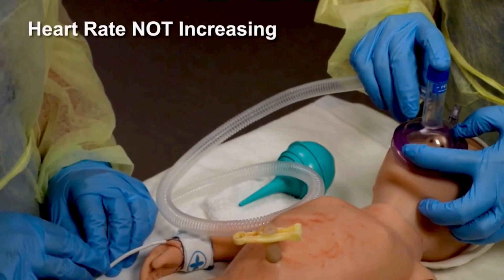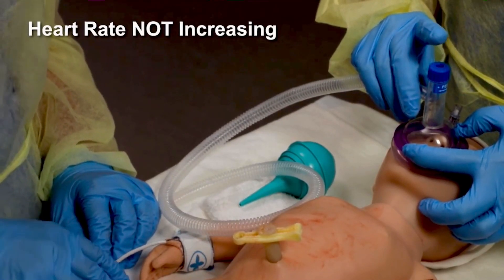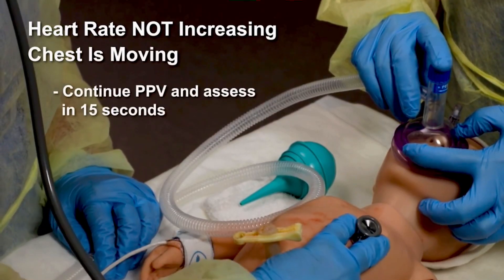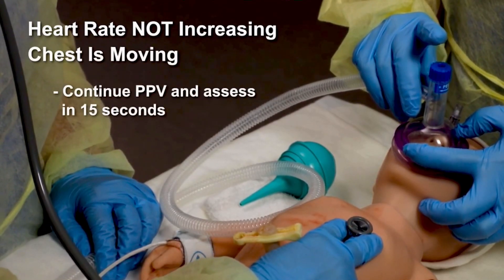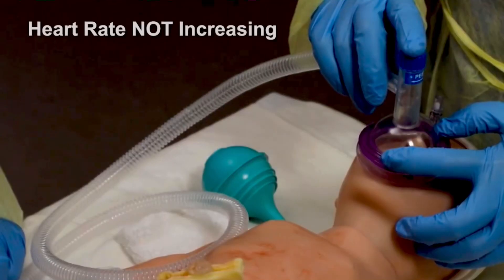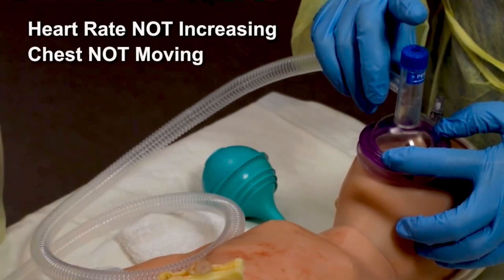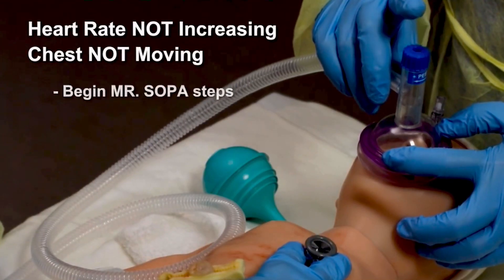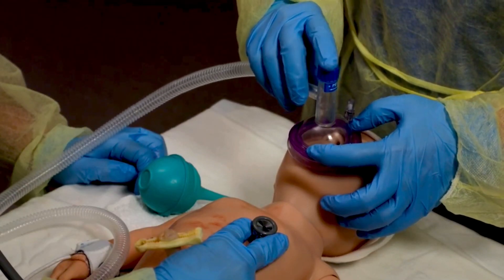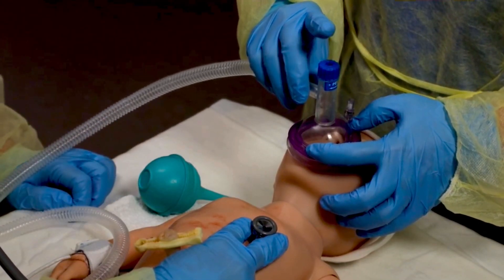If the heart rate is not increasing but the chest is moving, continue PPV and assess the heart rate after another 15 seconds of PPV that moves the chest. If the heart rate is not increasing and the chest is not moving, begin MR. SOPA ventilation corrective steps immediately. Move quickly through each MR. SOPA step until you achieve chest movement with PPV.